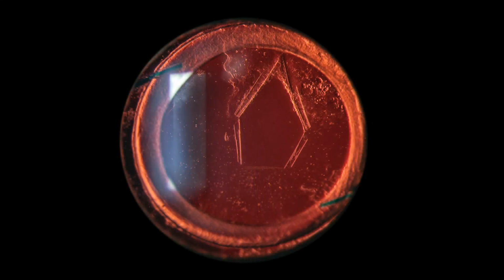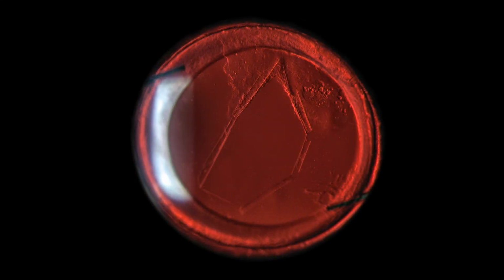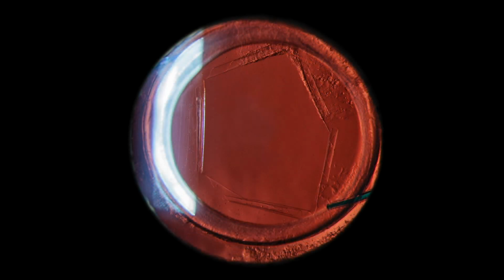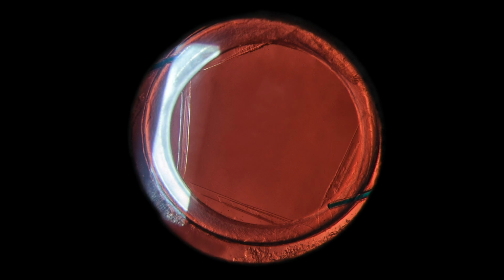Assuming a perfectly sized rhexis without the risk of a vitreous prolapse into the anterior chamber, I try to achieve a posterior capsule opening between 5 and 6 mm.